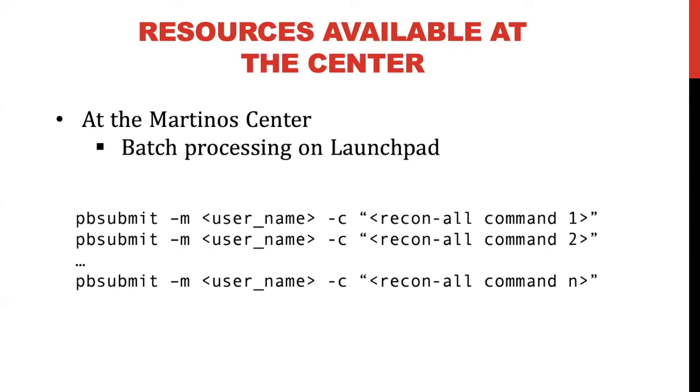If you wanted to do group stats, we also have a longitudinal pipeline, which I don't know if we mentioned, which is really helpful because basically what it does is it will process all of your subjects through recon all, and then it will create a base template and then compare each of your time points to that base template, and it will generate longitudinal stats for you. So definitely check that out if you're interested.